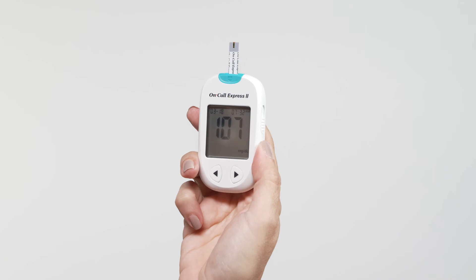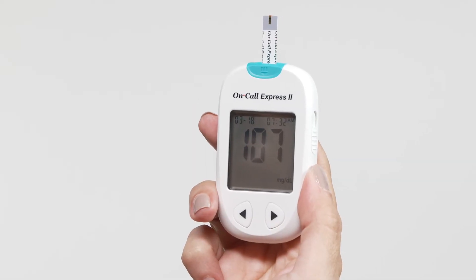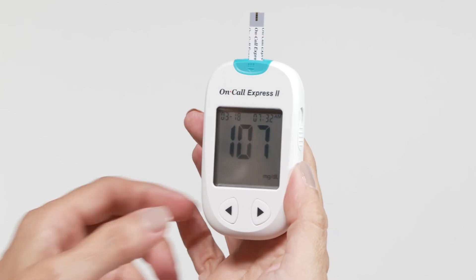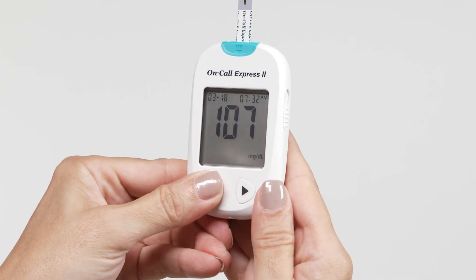Blood glucose results are automatically stored in the memory. Press the left and right button together, then press the left button to switch the marker from before meal, after meal, no marker, or invalid result.